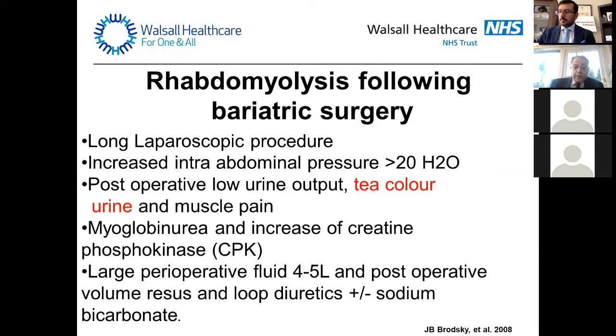So if you have a mega obese patient, try to shorten the operation and not to raise the pressure in the abdomen unnecessarily. A prolonged case, 5, 6, 7 hours, can be fatal in this.